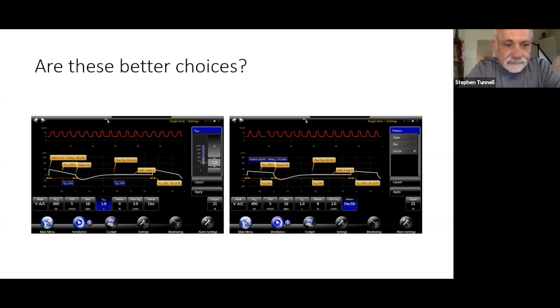Yep. Well, that's a good point, Steve, because the new modes of ventilation, for some reason, are not that popular. People still use old modes, and I can see Matt smiling there. We've all done these courses together before, and we still ask clinicians what they use, and they use modes like volume AC or SIMV, modes that are 30 or 40 years old. And even going back to the publications from John Marini showing patients creating huge negative inspiratory demand because the flow is not correct. Either the time is too long or the tidal volume is too small or whatever it may be, right? It's not being titrated.